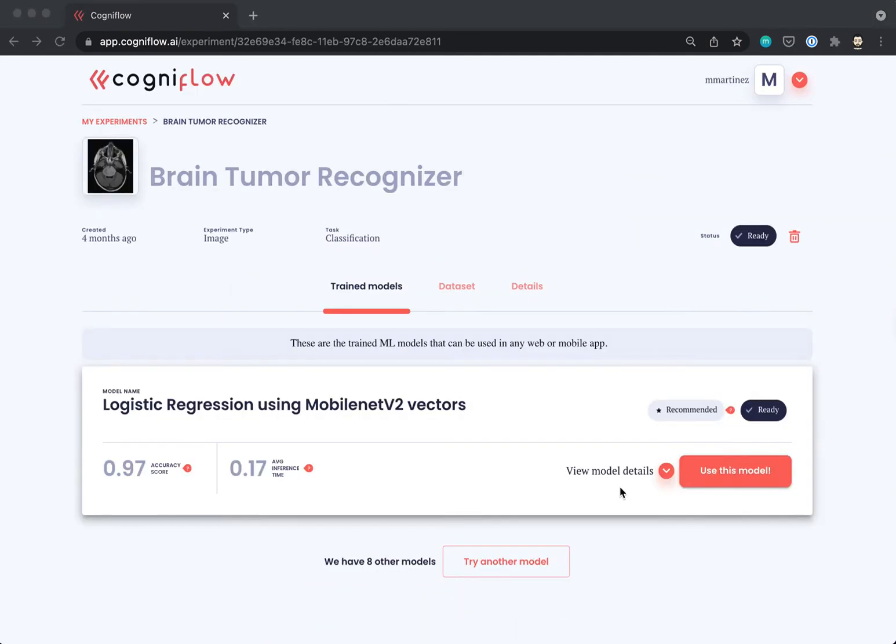After drinking a nice Colombian coffee, we are back, and CogniFlow identified the best model for this problem. Let's see how it works.